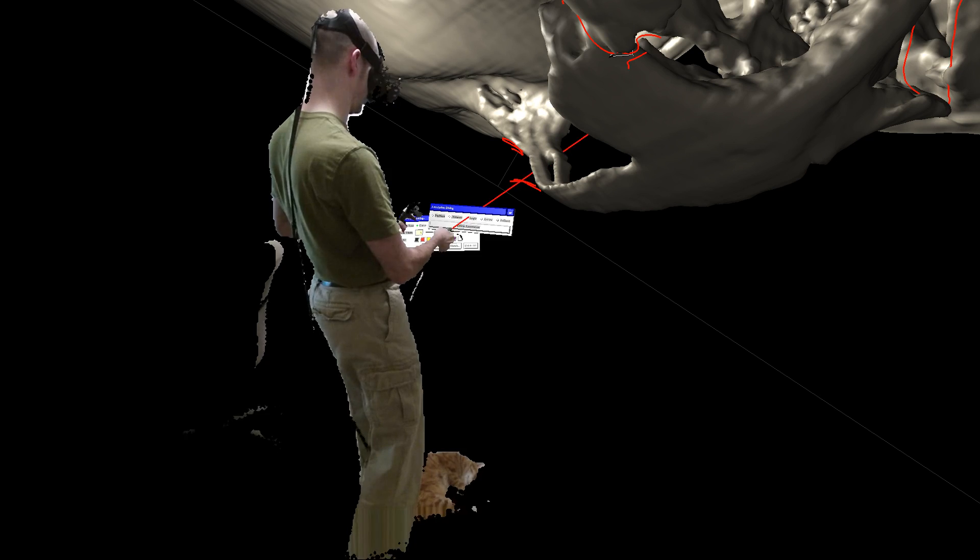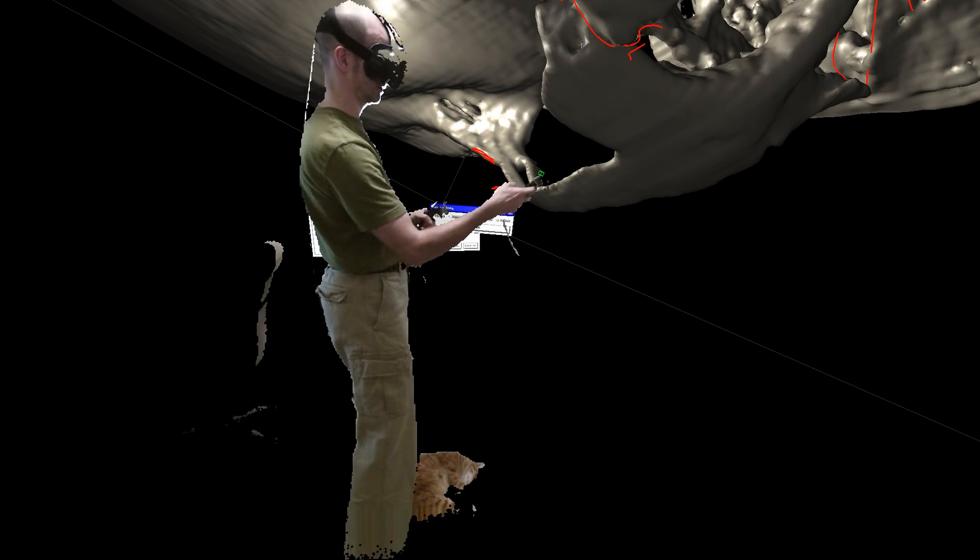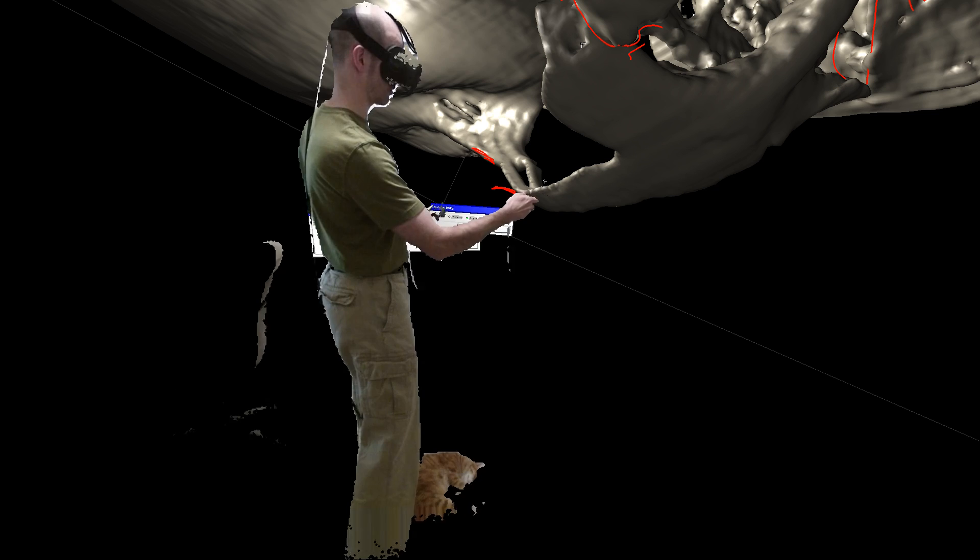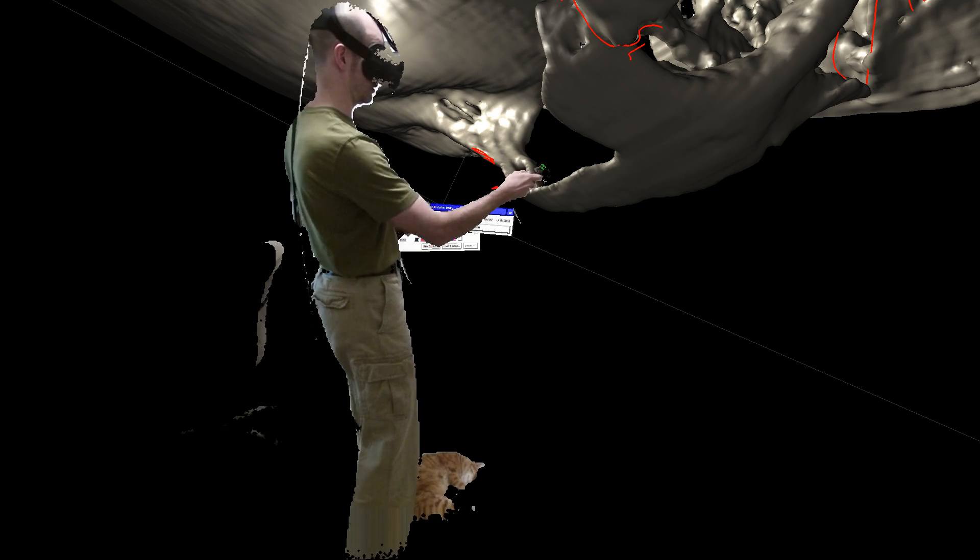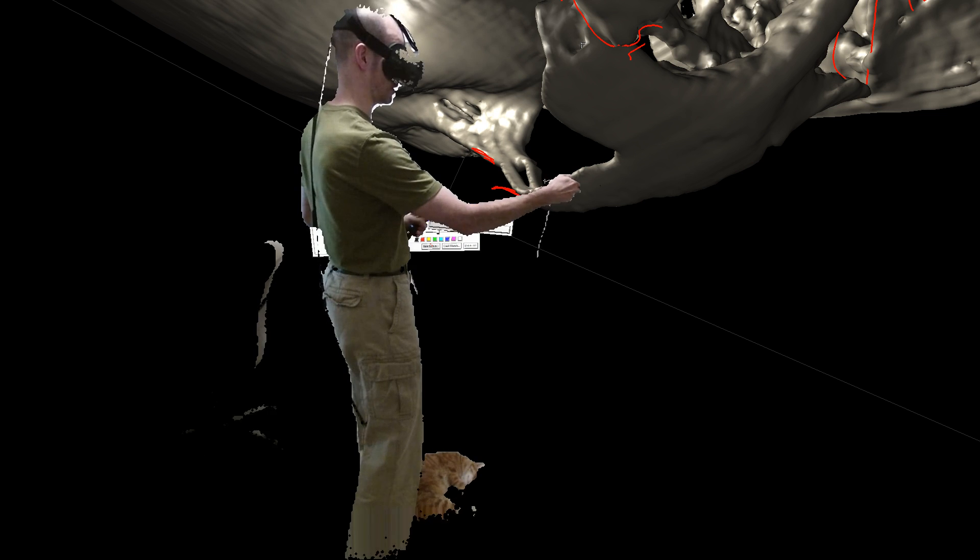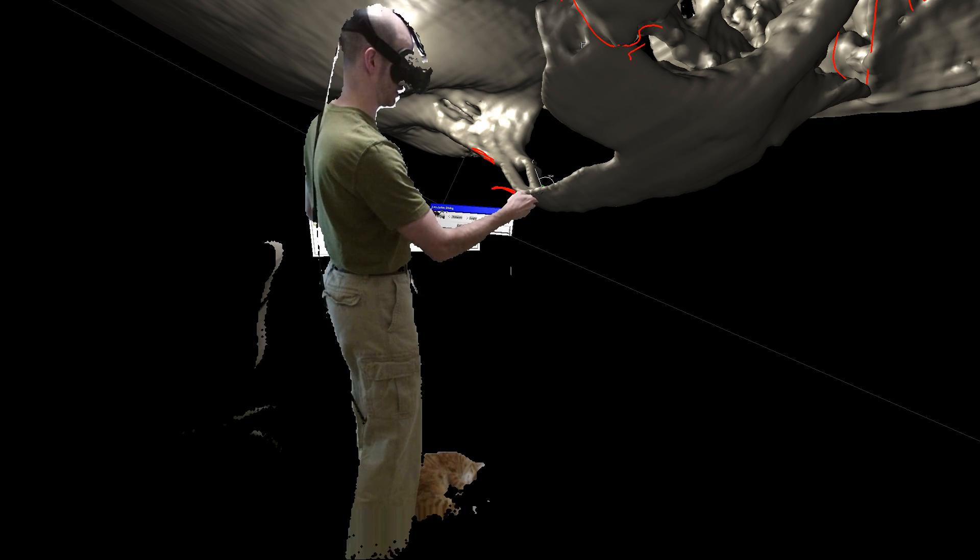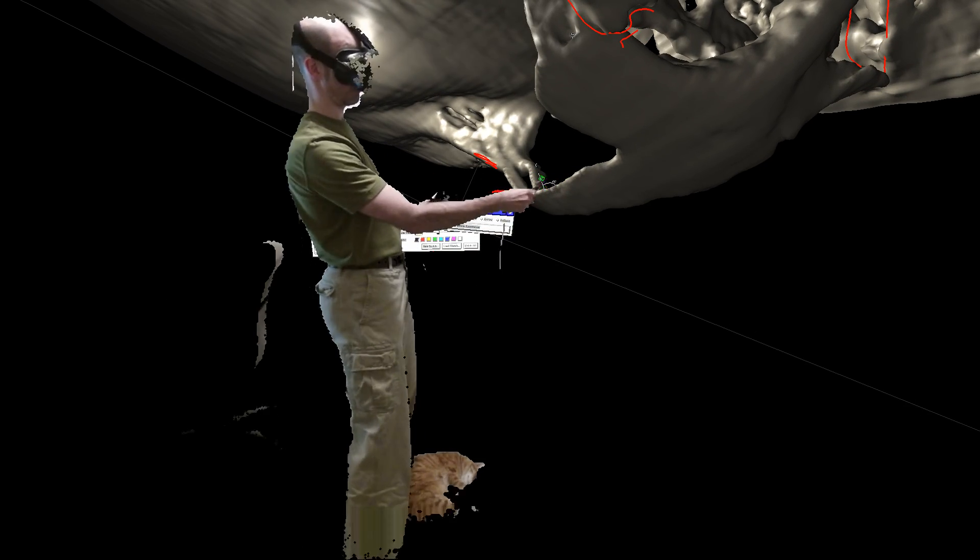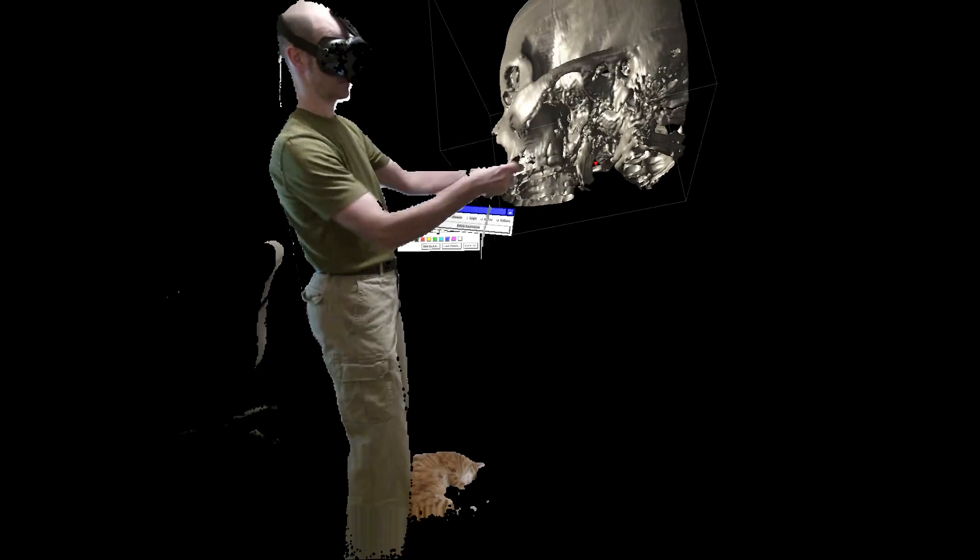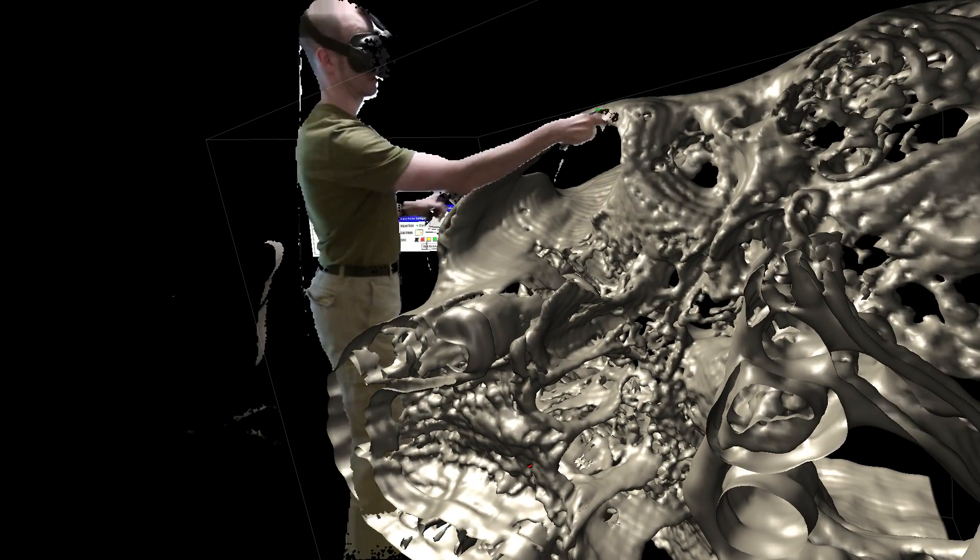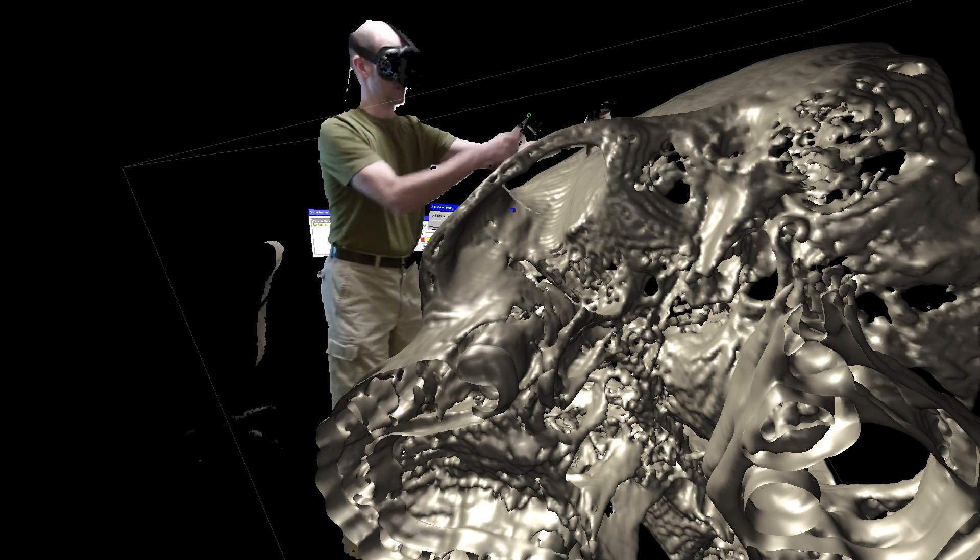And in this case, we can go in and measure the angle by putting your measurement point. And then that way. And then we can move this guy back where it belongs. And we can see that now this bone forms an angle of almost 90 degrees, 107 degrees to be precise. If you compare it with the other side, you can see this is what it's supposed to look like, nice and smooth, going across, not bent like that.